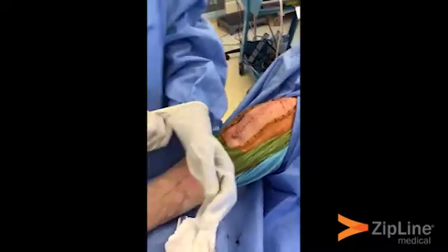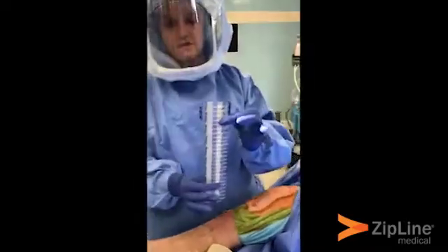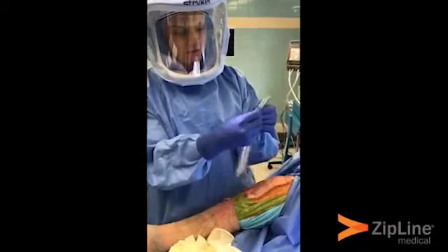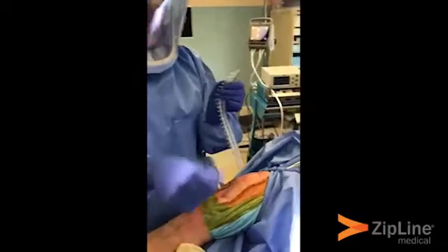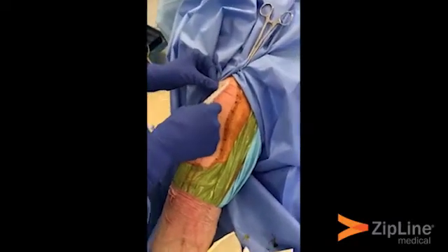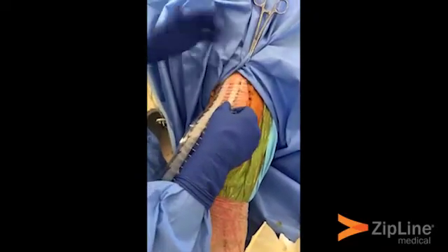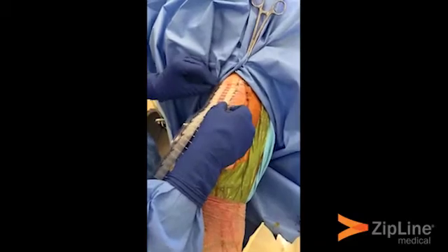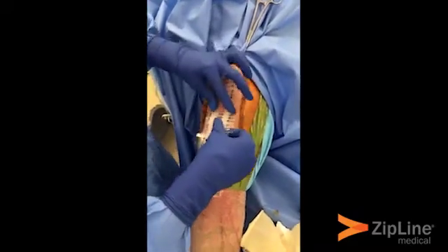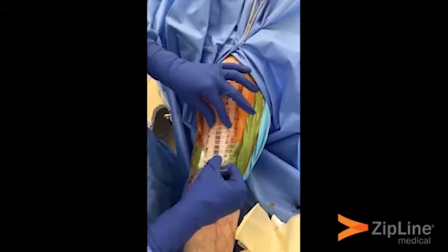Take your dirty gloves off so you have nice clean gloves. Here's the Zipline — it's very self-explanatory. There are two tabs, number one and number two. You start with tab one, pull it up and away, and apply the Zipline. Put one zip tie proximal to the most proximal portion of the incision, lay that area down, make sure the incision is centered on the Zipline, then peel tab two back as you gradually lay the adhesive portion down, leaving the incision at the center.